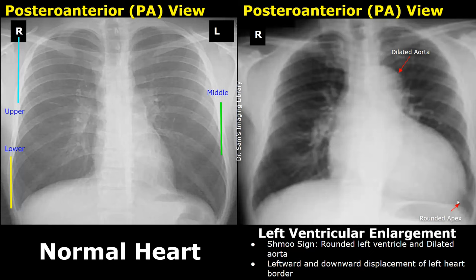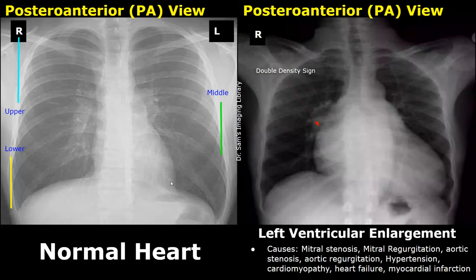Whereas in the normal image the apex is not rounded and is not displaced towards the left or downwards. Causes of left ventricular enlargement include mitral stenosis, mitral regurgitation, aortic stenosis, aortic regurgitation, hypertension, cardiomyopathy, heart failure, and myocardial infarction.